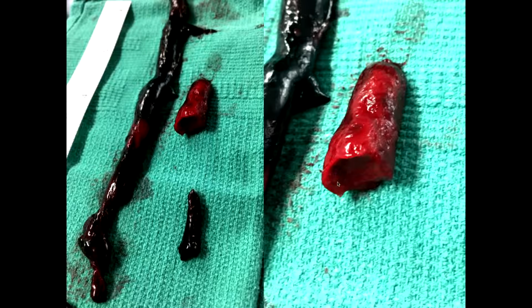And so we really like it when we pull this thing out and go, oh, there's the plug. That means you got what you came to get out of it, and usually means you've got pretty good flow. You've got to do an arteriogram to confirm it, but that's essentially what it means. Many people use the term meniscus for that. So you're looking at that hollowed out surface where there's flow. You see that, you know you've gotten to the end of the thrombus. You don't have to make a lot more passes.